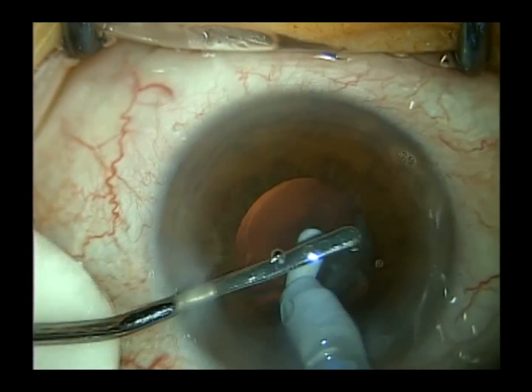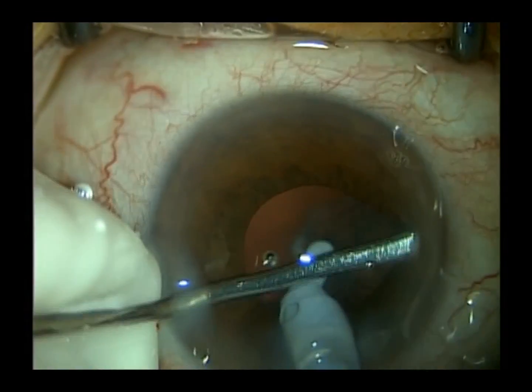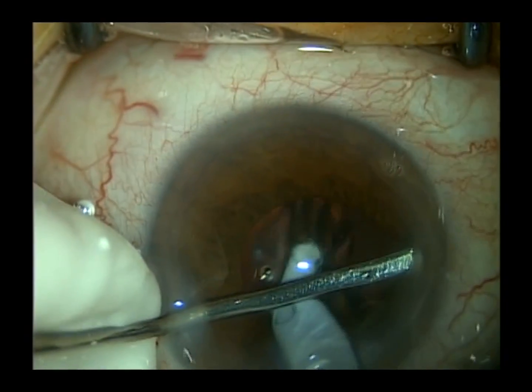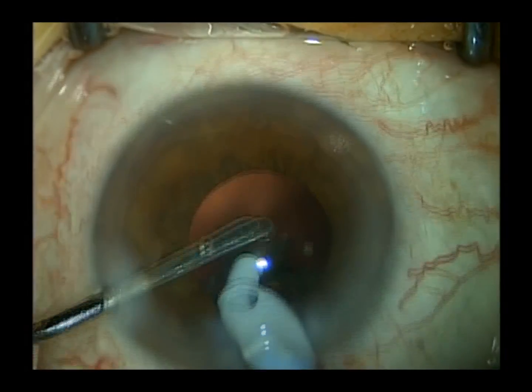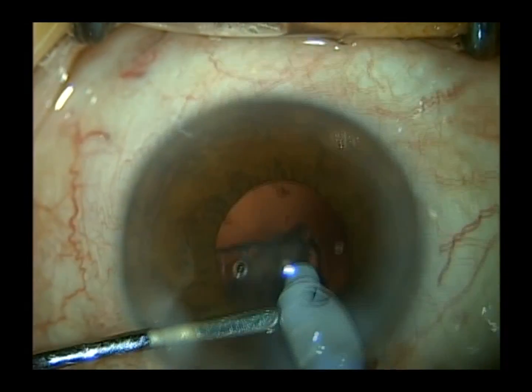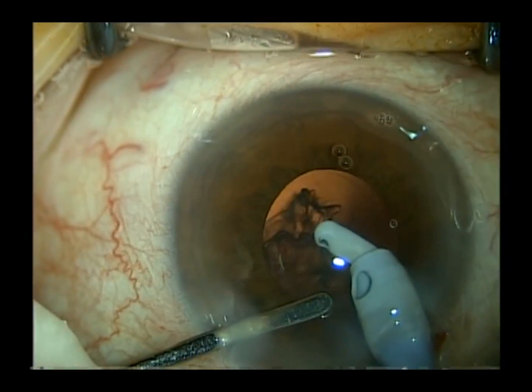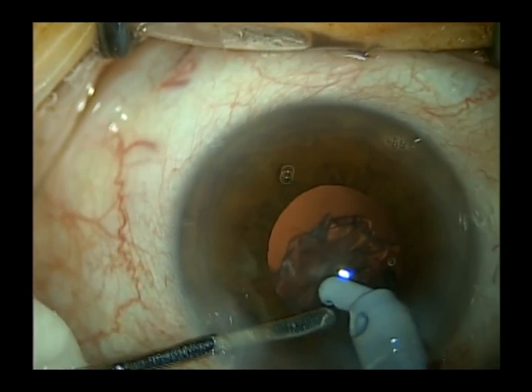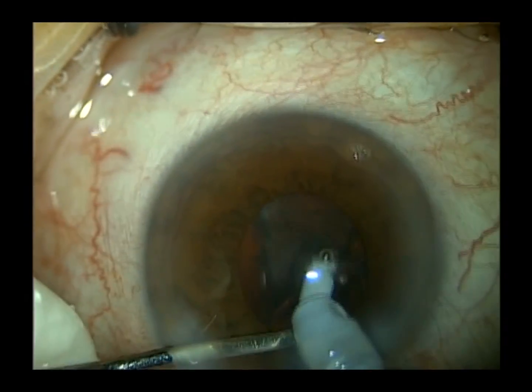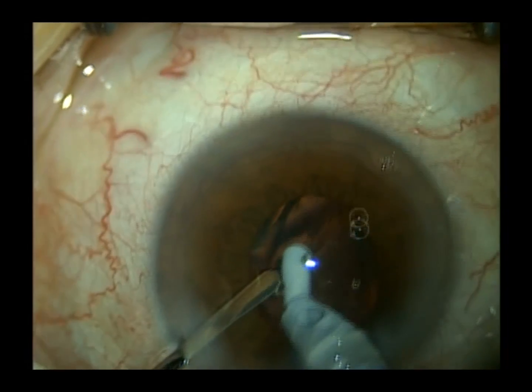So I don't want to ever place my irrigation and aspiration tip where I can't see it, so I just use the collar button to reveal the area. The IA tip has a silicone sleeve on it, which is very capsule friendly. This silicone sleeve is made by MST Microsurgical.